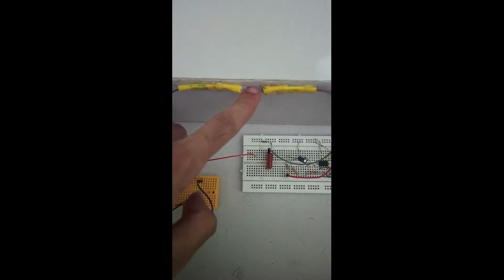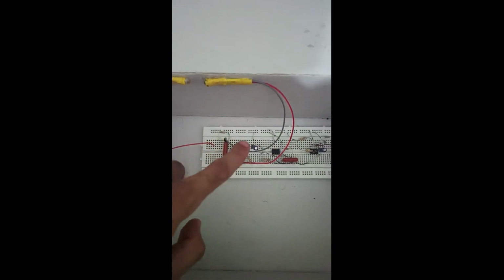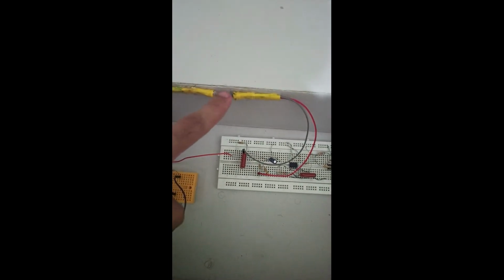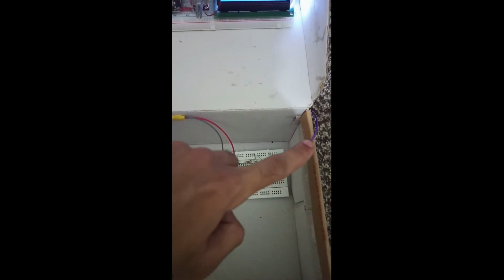Here is the sensing area in which the user or the patient places his finger, and then this is the analog to digital converter block which converts the analog voltage received by the sensor and sends the digital form of the voltage to the controller, which is displayed on the LCD.